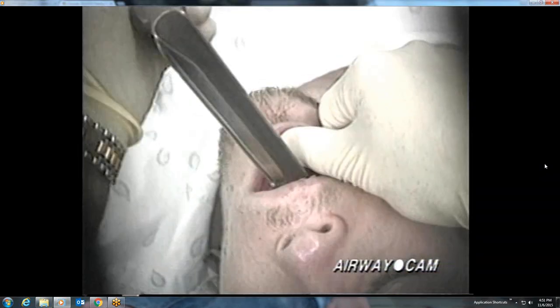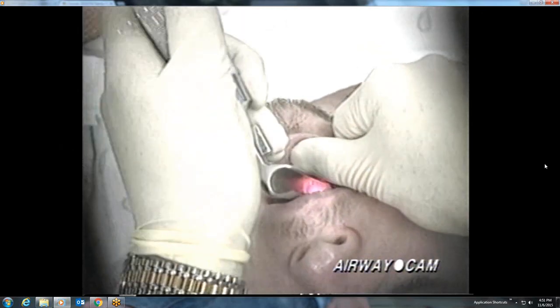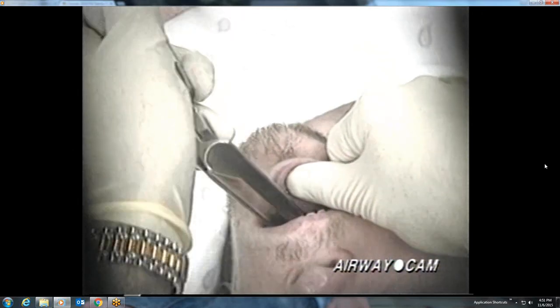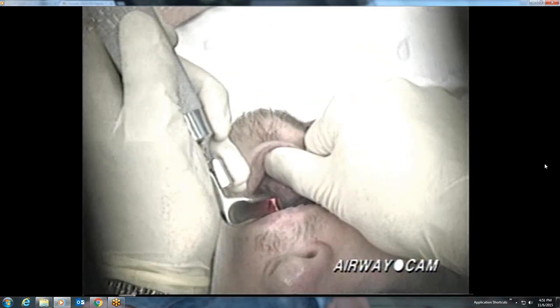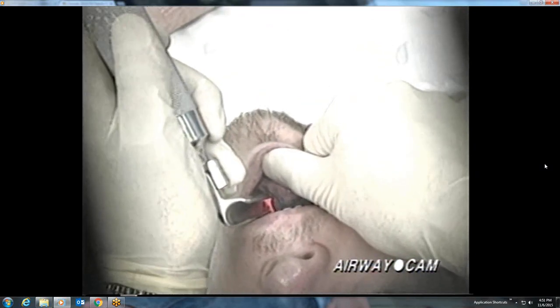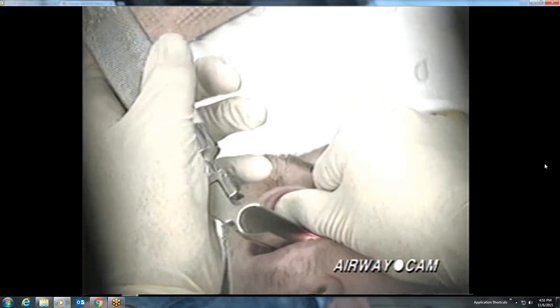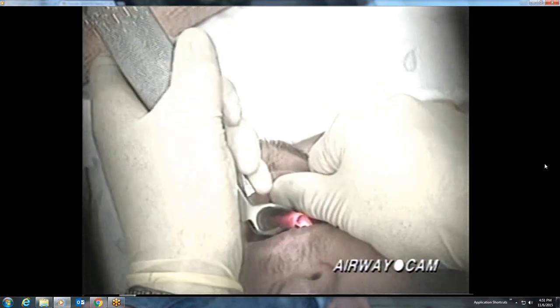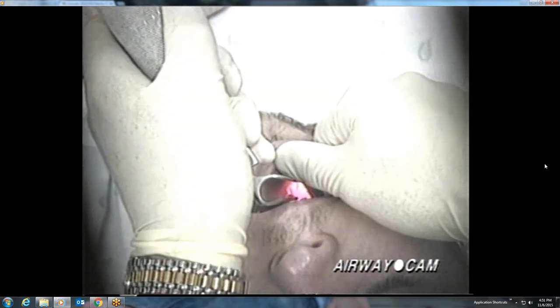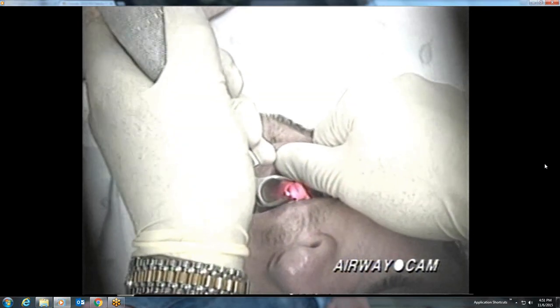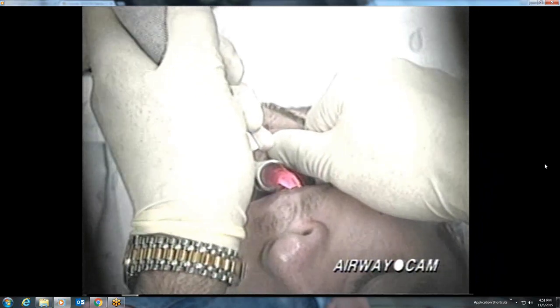Returning to a straight blade, this next intubation initially demonstrates how placement of the blade on the left side causes the tongue to completely obscure the view. After repositioning the blade correctly down the right side, the laryngoscopist makes repeated attempts to pick up the epiglottis, also maintaining a scissor technique to keep the mouth open, thereby aiding visualization.